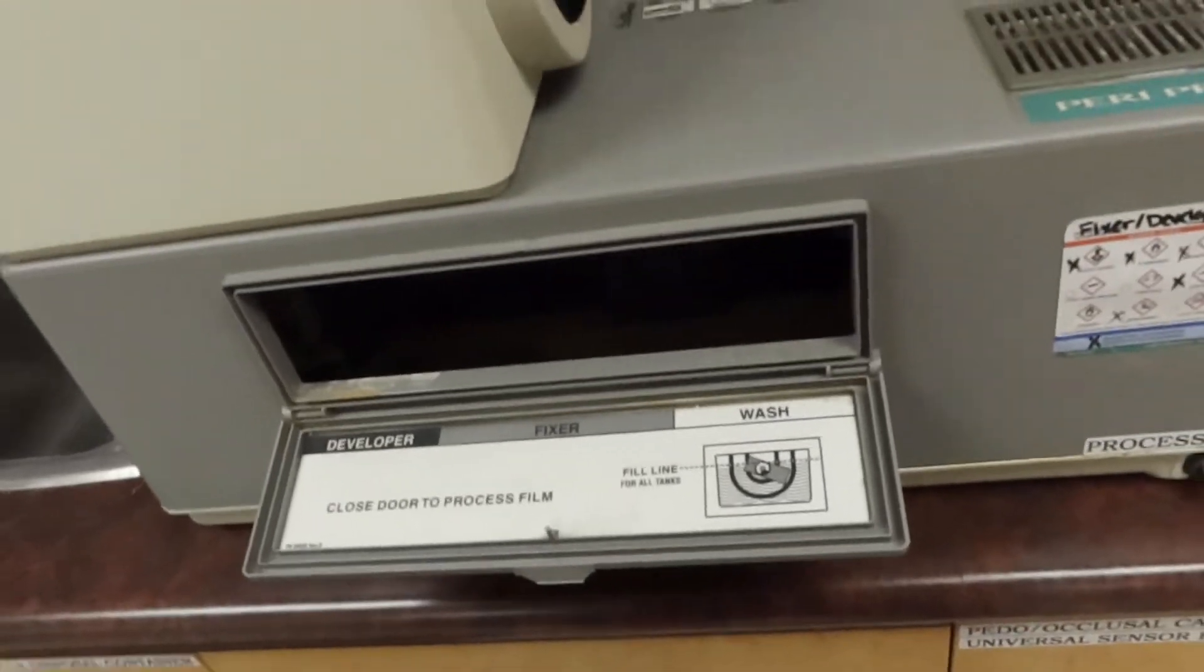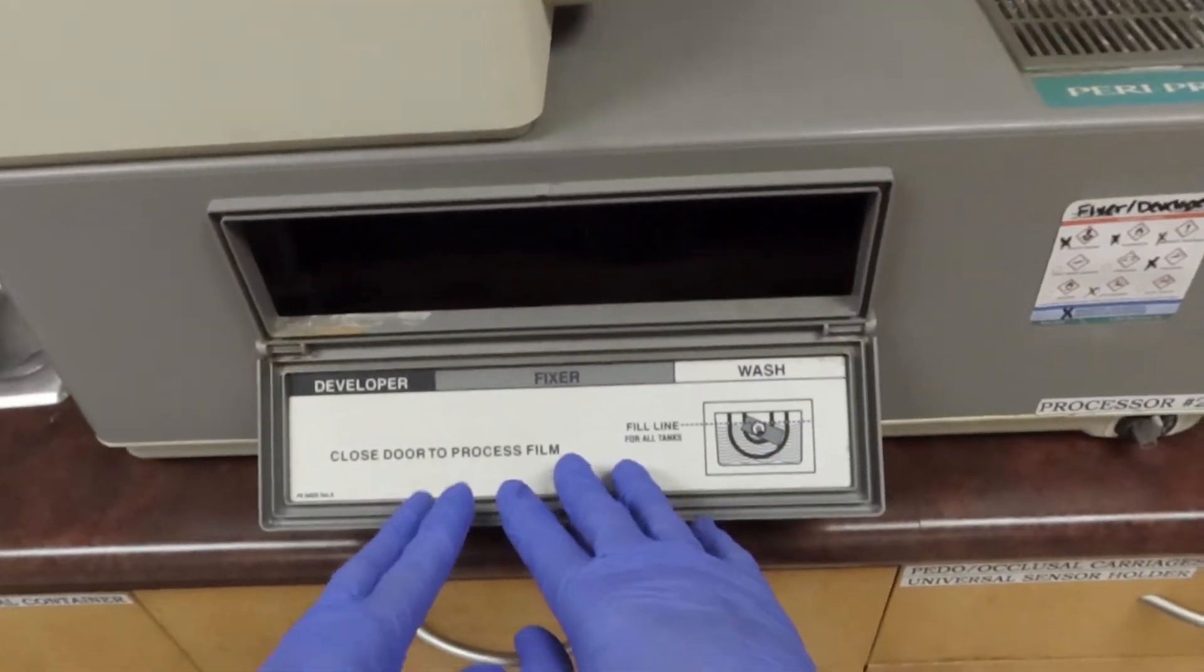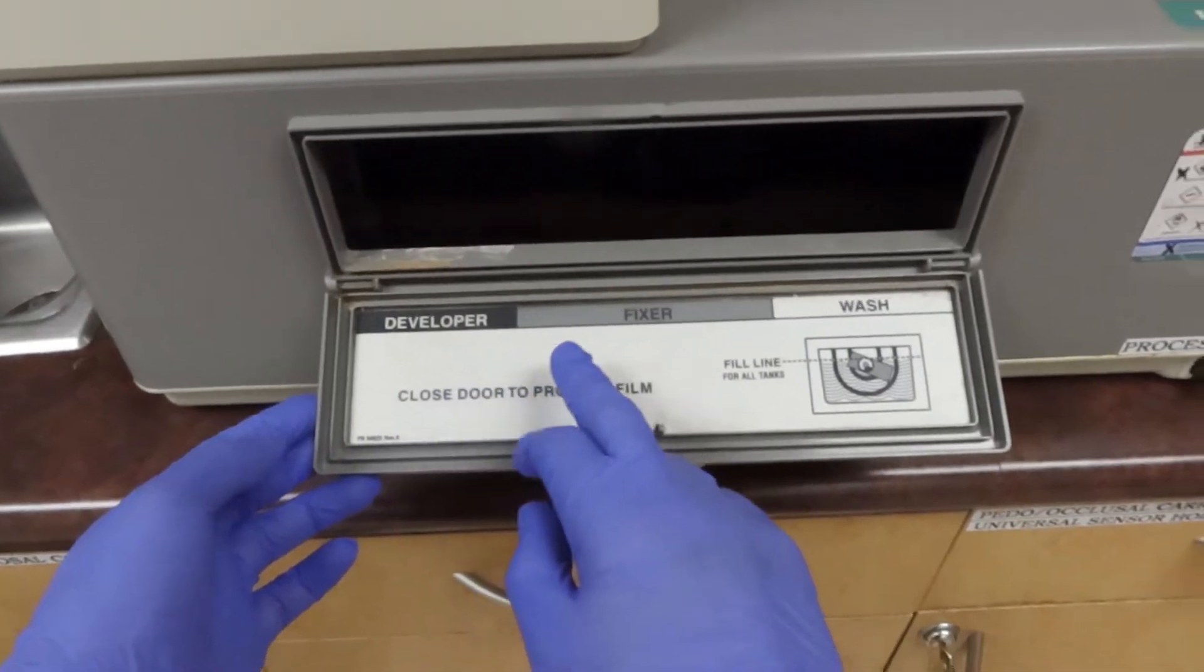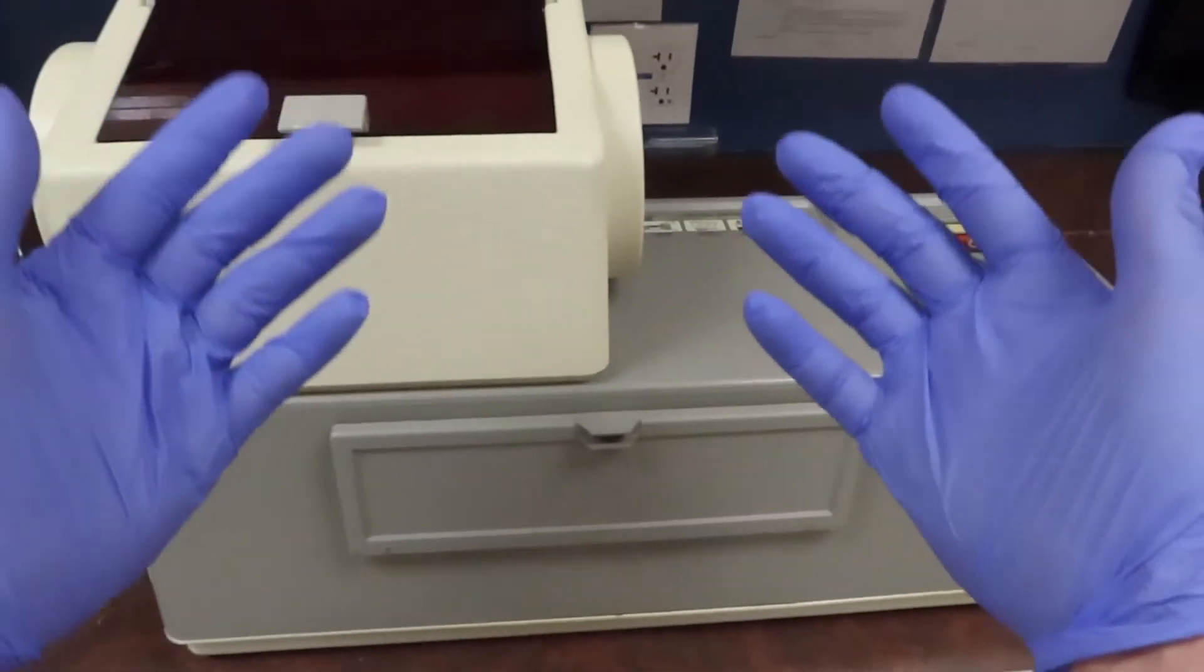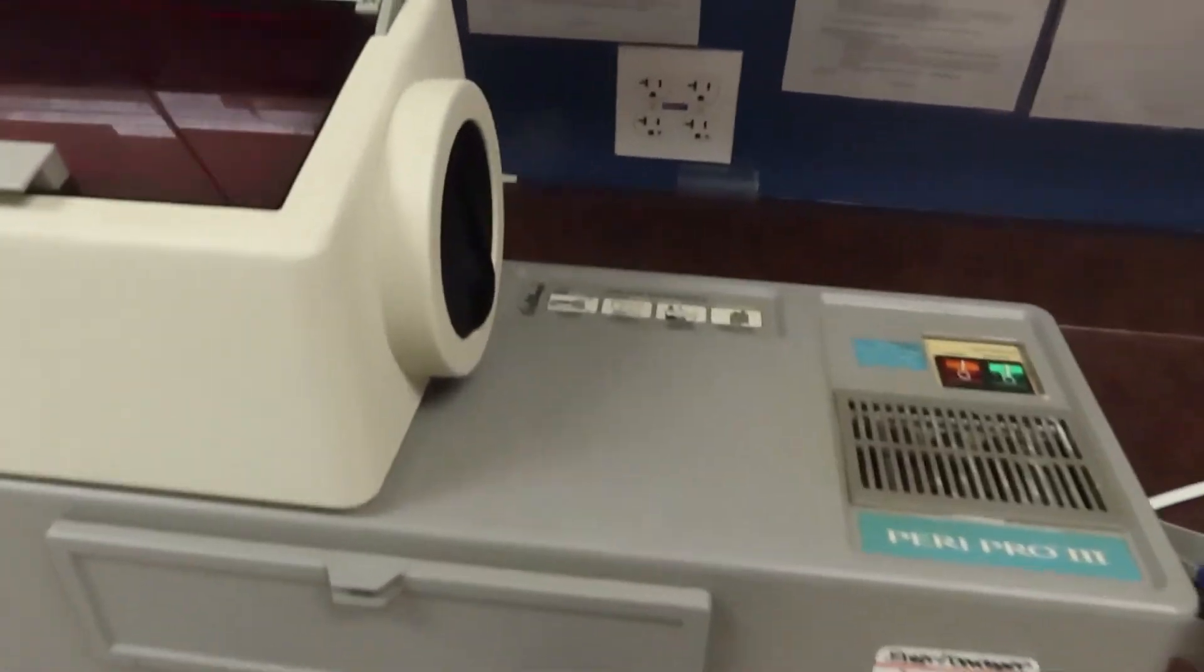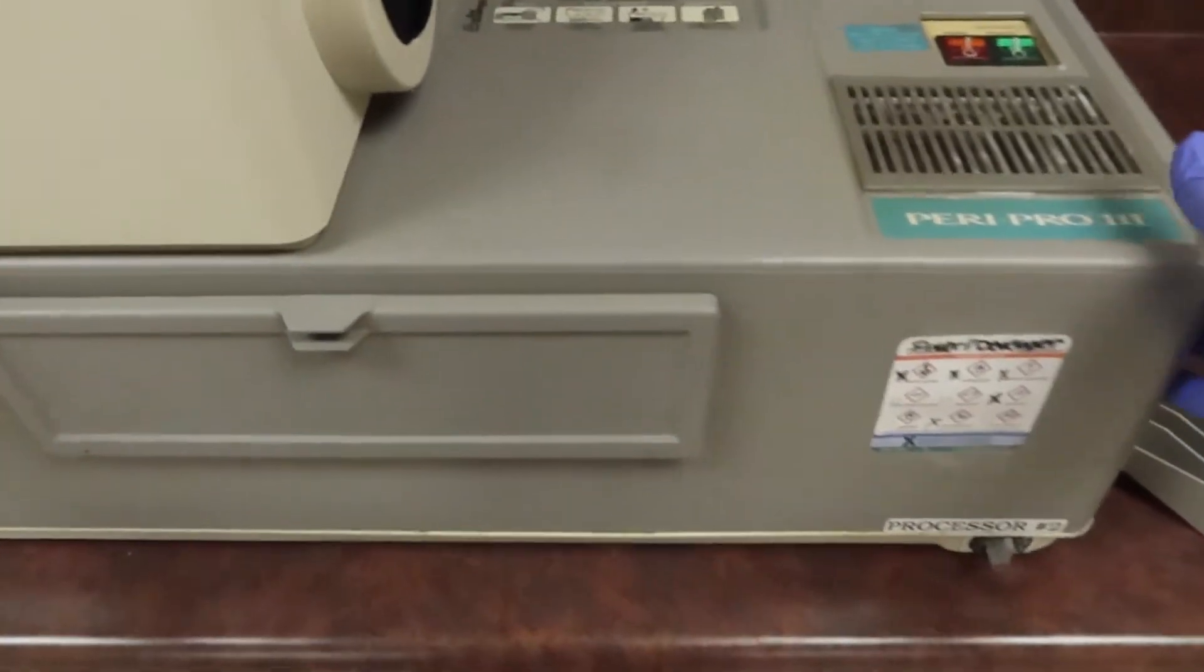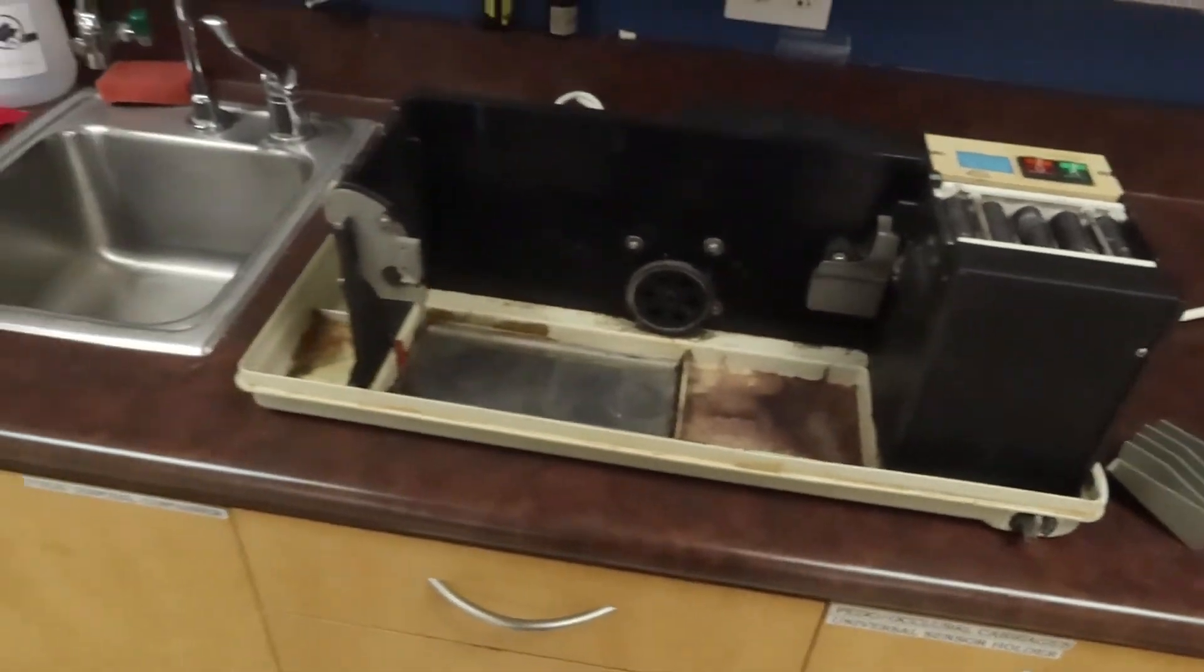Never mind, thought there was a monster in there. If we look in here, we're gonna see that we have different sections: developer, fixer, and wash station. If we go ahead and just open and take this whole bit off, we can see the actual guts to this.